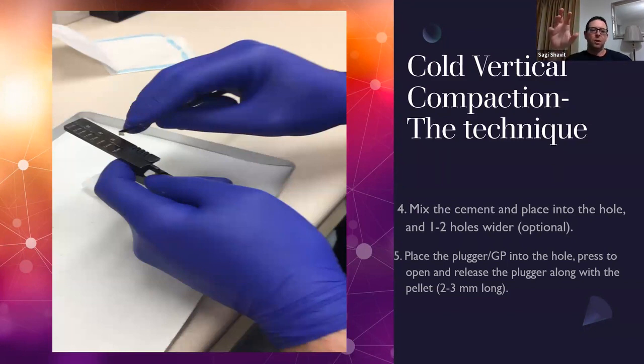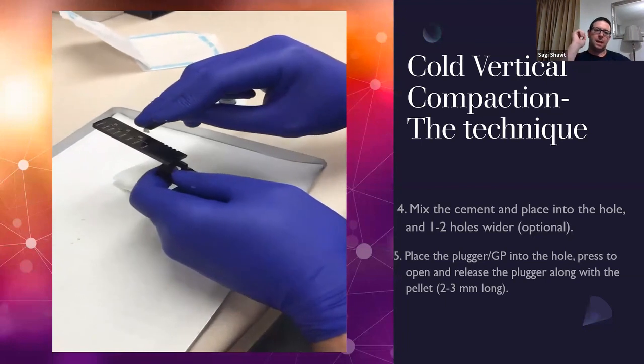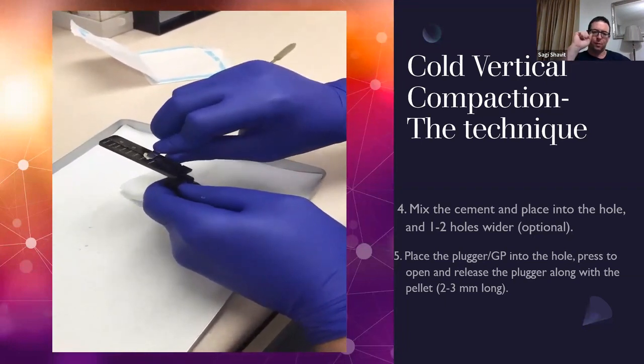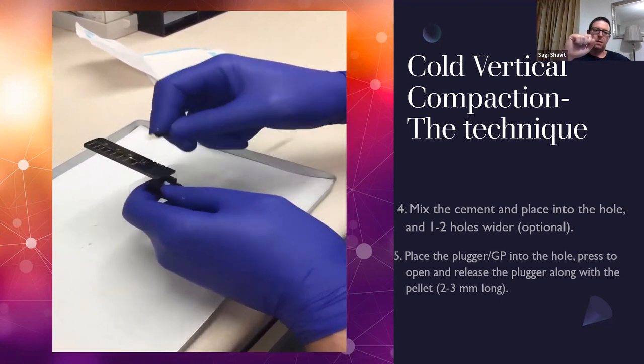Now, if you're using a non-premix, so you need to mix it, for example, biodentine or BioRoot RCS, or if you're using a premixed putty, which to be honest with you, I prefer, you place it into the holes, okay? Just like that. Now, when you place the cement into the holes, make sure you press on it, okay?